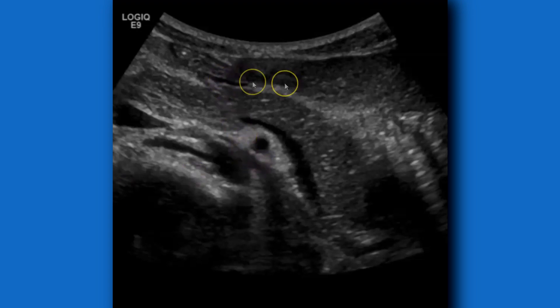We're here in the epigastric region, transverse and slightly to the left, angling towards the spine medially. Right up front we have the rectus abdominis muscles with the linea alba in between. We have the left lobe of the liver — not the right, because we're in the epigastric region and also oblique, since the pancreas is not a perfectly horizontal organ. You may need to oblique several degrees either way to get a good complete view.